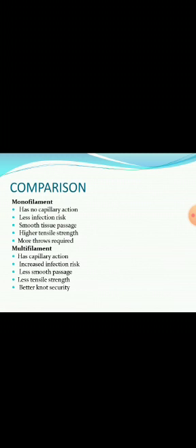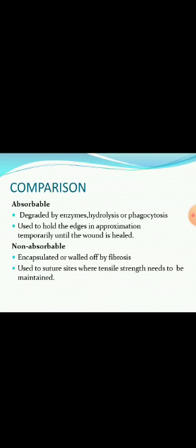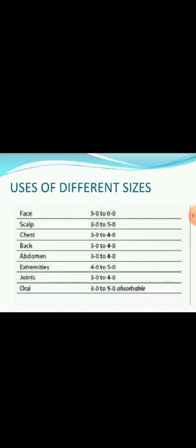Let's have a look at the comparison between monofilament and multifilament. A comparison between absorbable and non-absorbable ones. Now this is the use of different sizes.